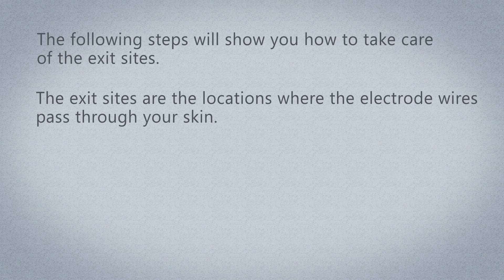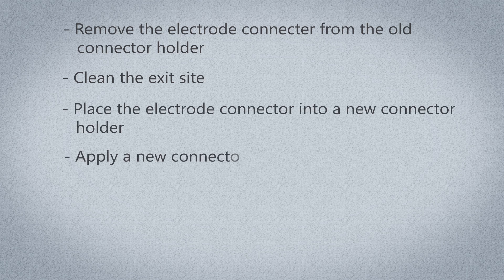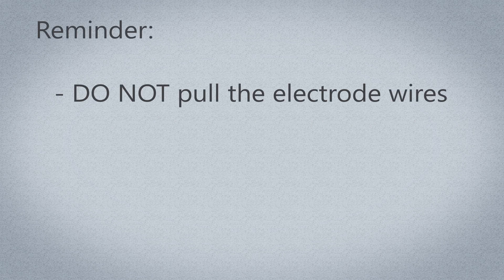Care of exit sites. The following steps will show you how to take care of the exit sites — the locations where the electrode wires pass through your skin. The steps will show you how to remove the electrode connector from the old connector holder, clean the exit sites, place the electrode connector into a new connector holder, apply a new connector holder onto the skin, and cover the existing electrode wires with gauze and transparent dressing. You should perform these steps every three days or more often if the dressing becomes wet or soiled. Important: do not pull the electrode wires, as doing so may pull more electrode wire from under the skin.